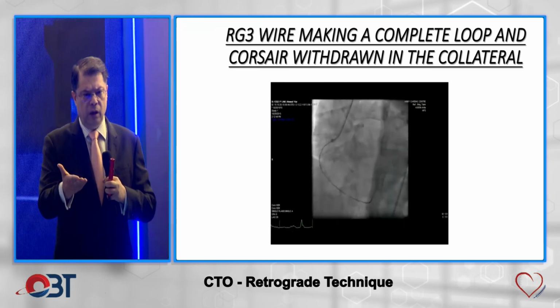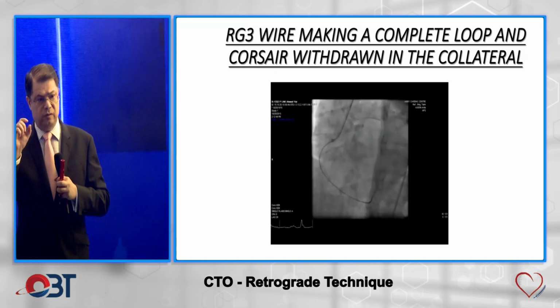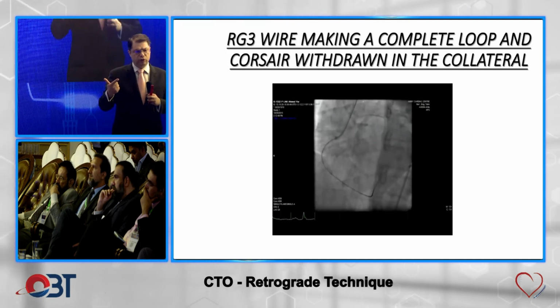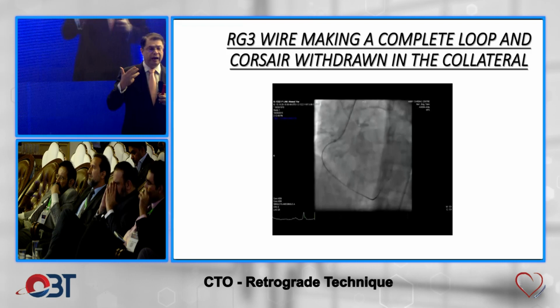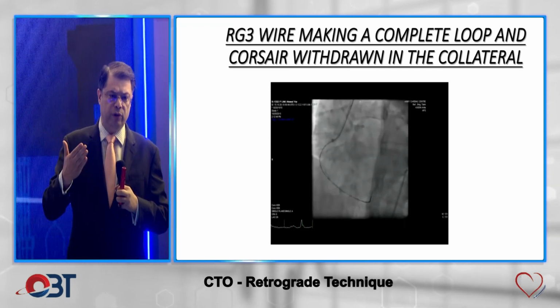That could be another thing, because in an ostial CTO, generally the proximal cap is ambiguous. So if your proximal cap is very clear, even in an ostial CTO, you can try antegrade. But if it is not clear, your CTO is more than 20, you don't have a good distal landing zone, and the 4th thing is that you have good interventional collaterals. That's very important.